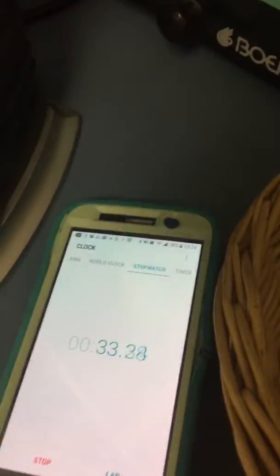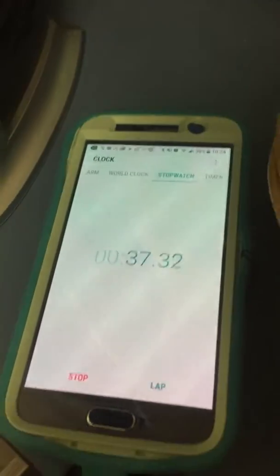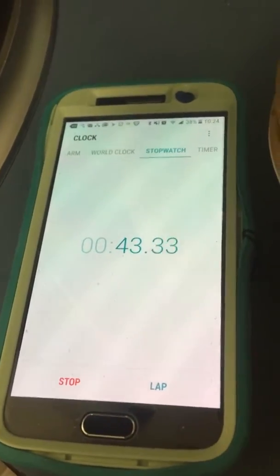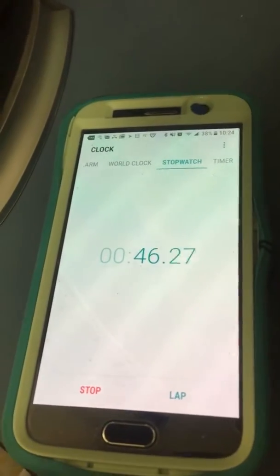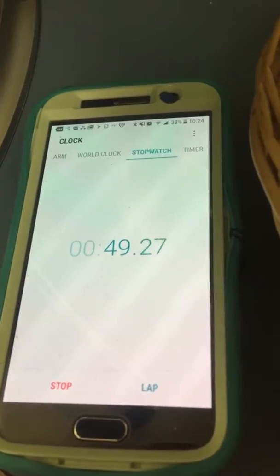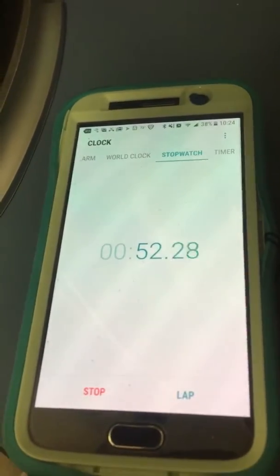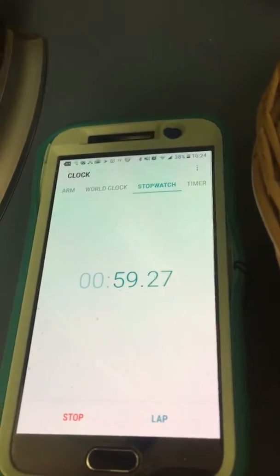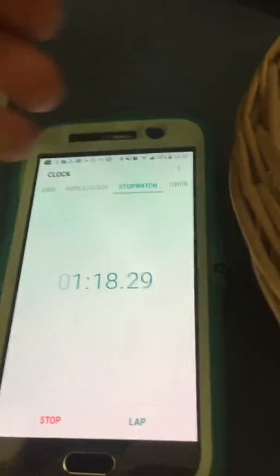We're going to take it out and see if the blood has clotted. So that's for testing the blood clotting time. It's been 60 seconds, so I'm going to manually check and put it back in. It's going to be a little longer. We're going to check every five seconds.